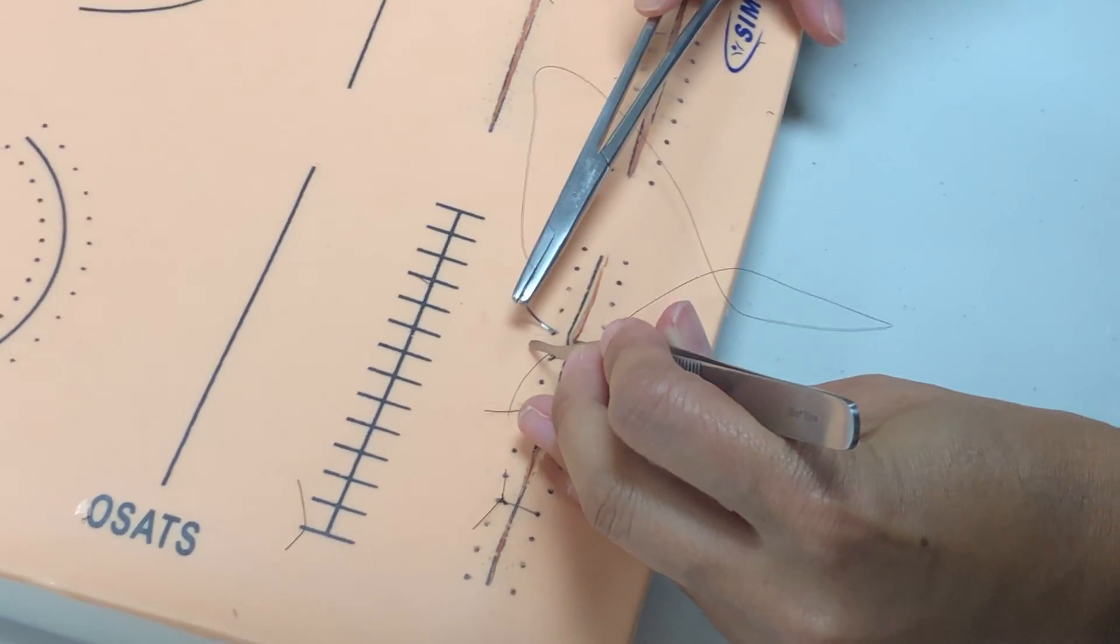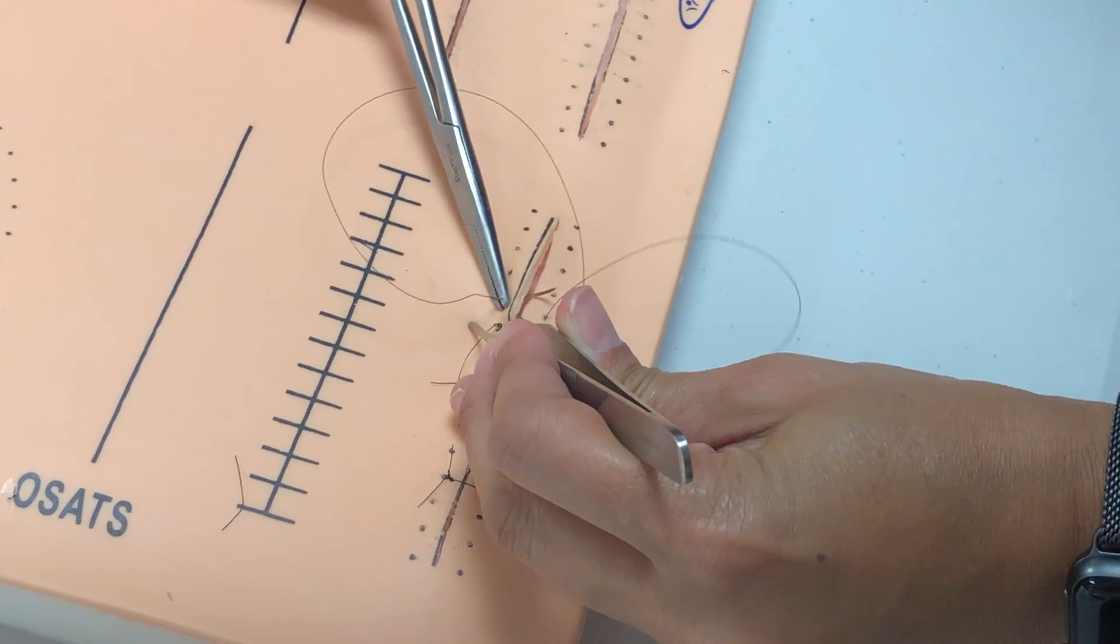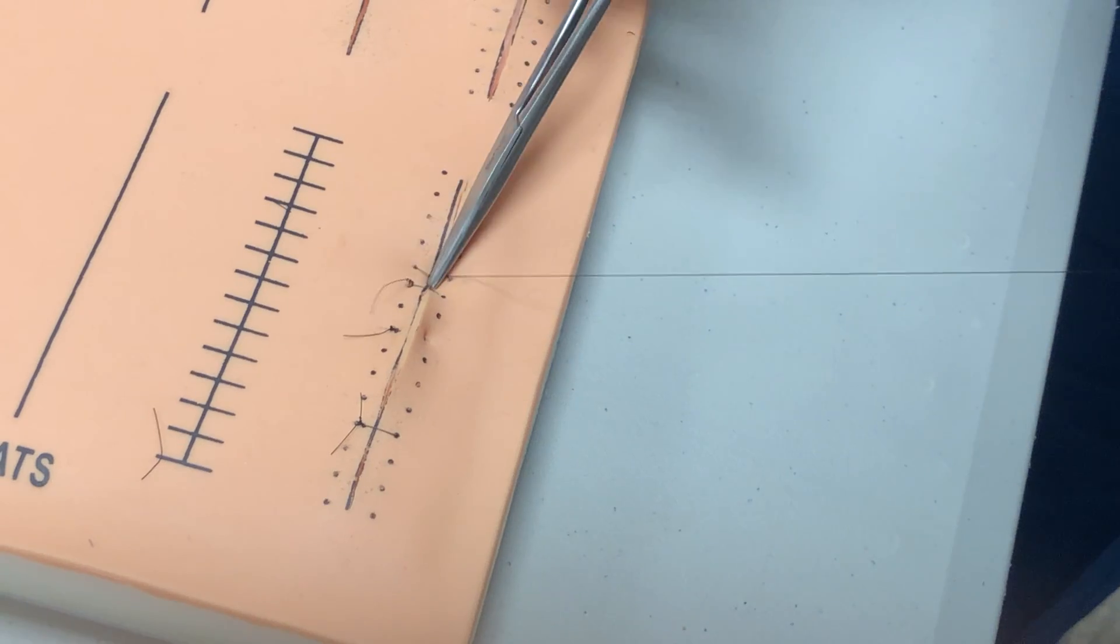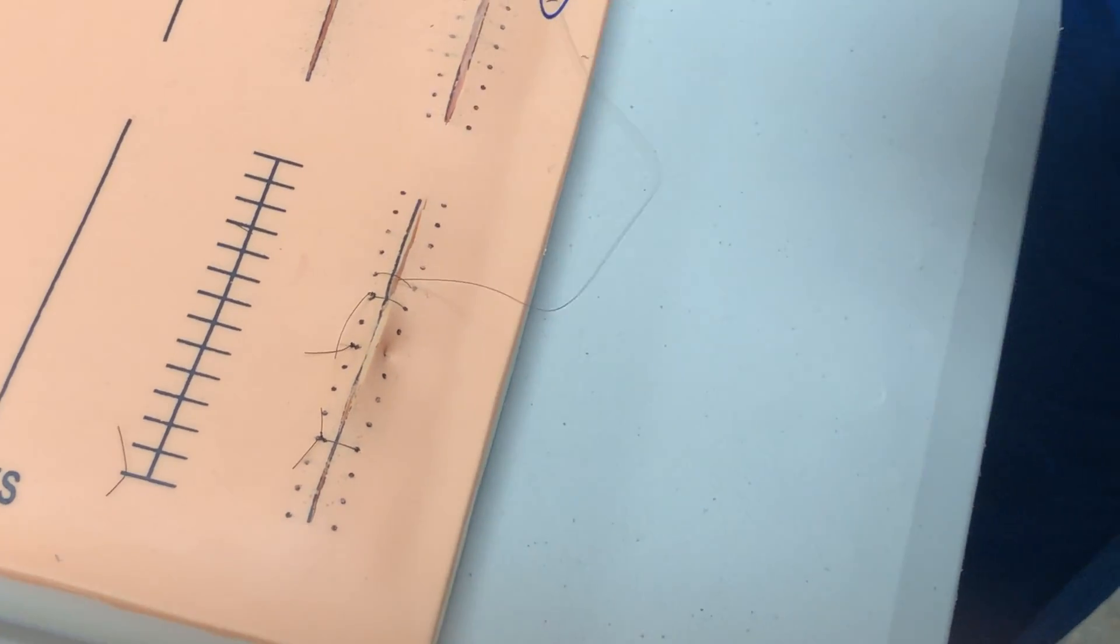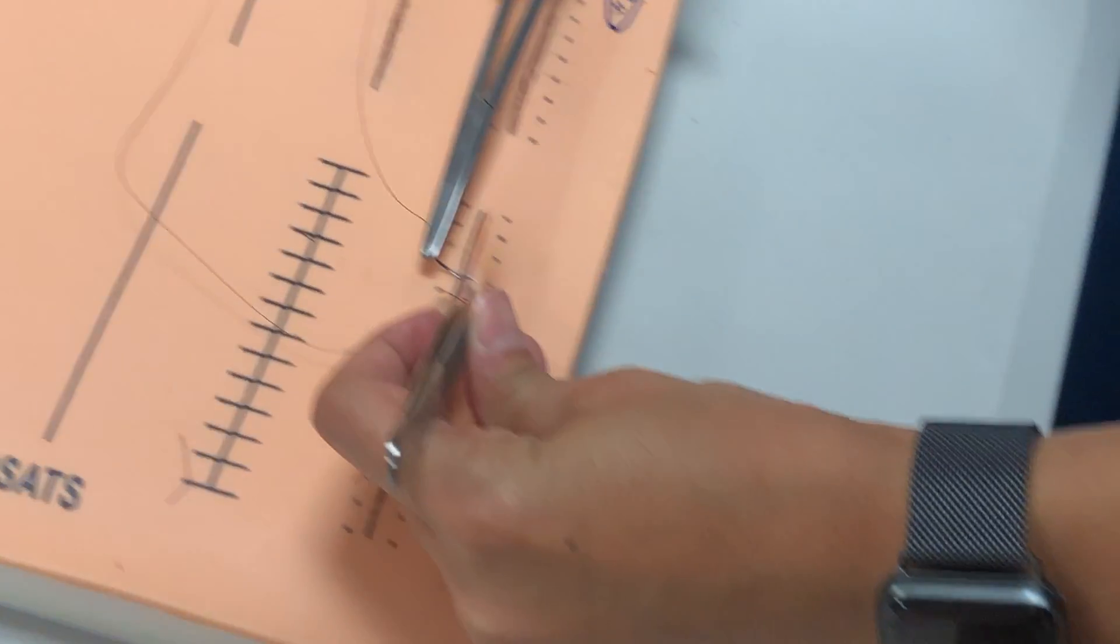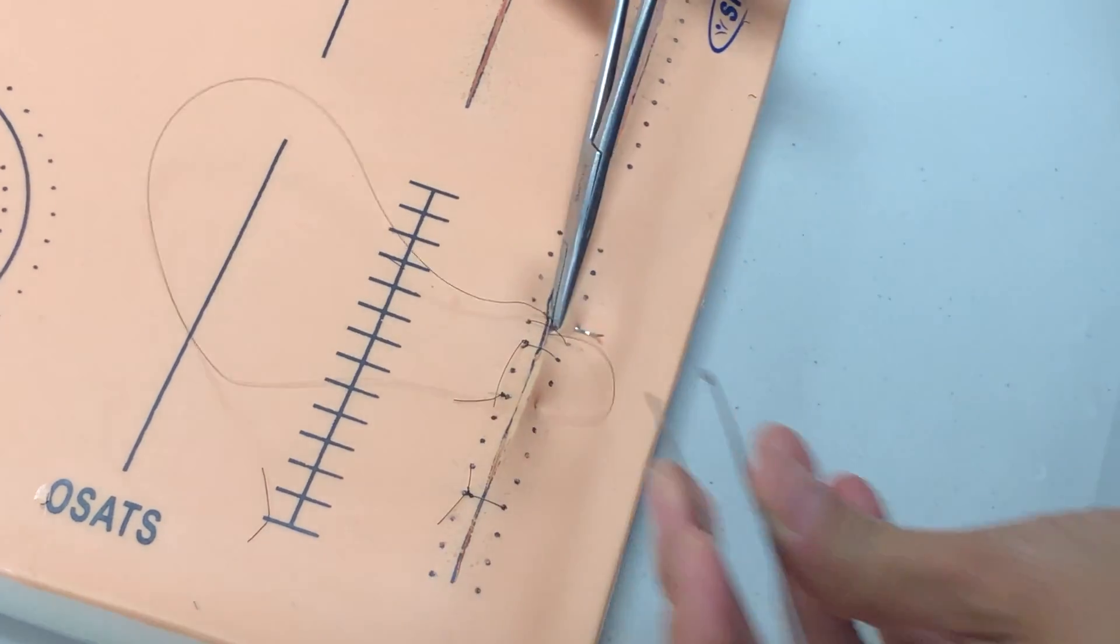So I'm going to grab right here, take a bite, and grab this, and just kind of lay it down like that, coming out diagonal.